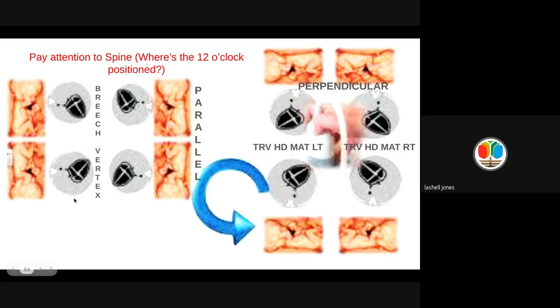Okay. But what's important is the spine locations. Clearly, we can see when they're perpendicular, whether it's spine up or spine down. Perpendicular, that's a transverse line across, creating the T. Parallel line, longitudinal line, you see the spine locations.